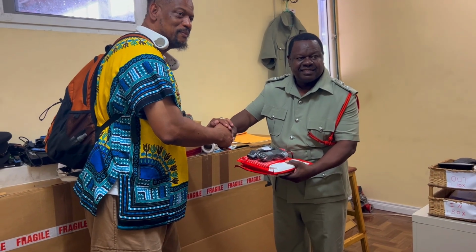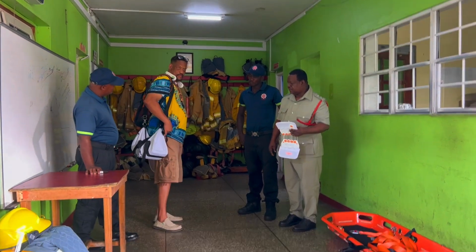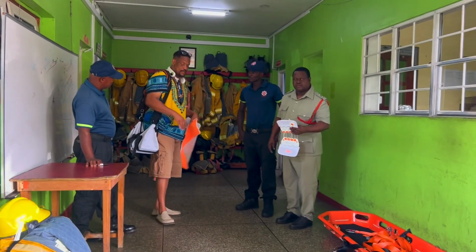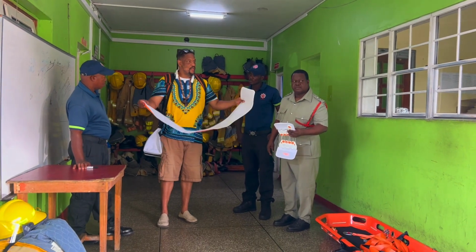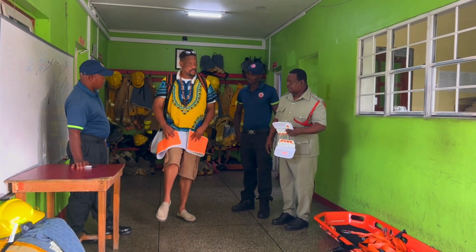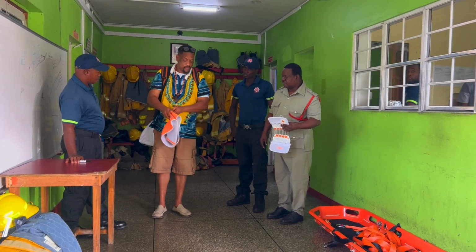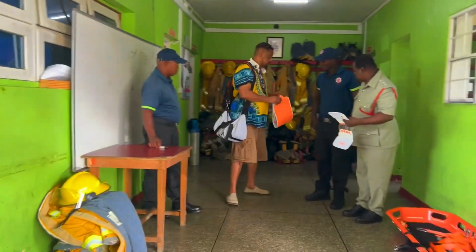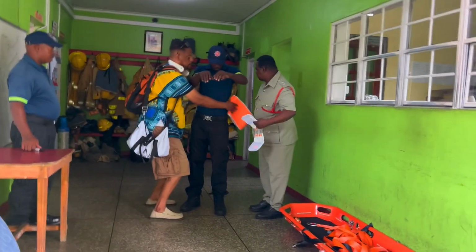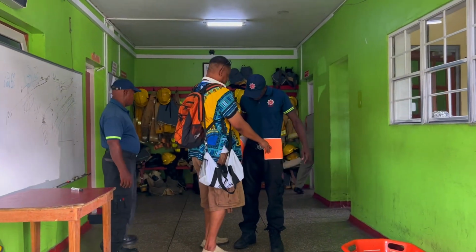What you pay attention to is the anterior superior spine, right here. Pass that under the patient. Obviously, if they're big, you could fold it. What you want to do is bring it around so it comes up front. So that's good. We will put that right around here for the piece.